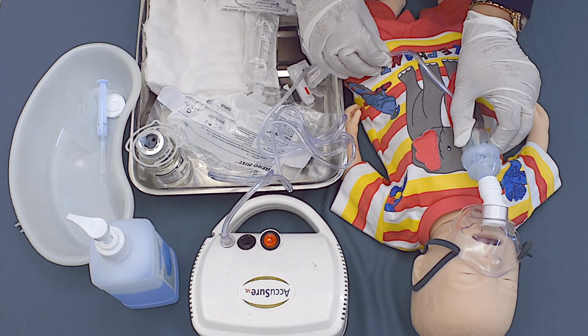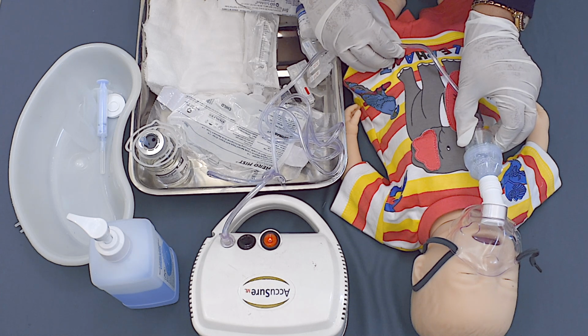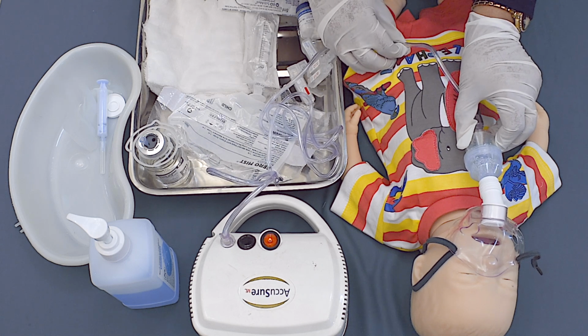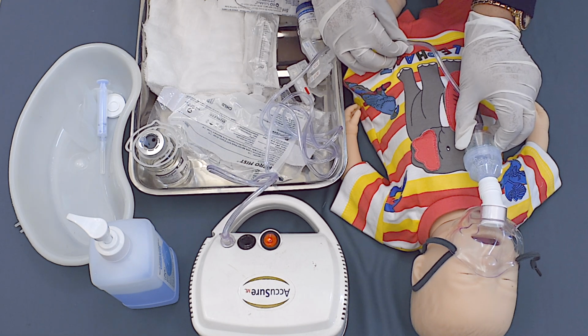While the baby is inhaling the fumes, instruct the baby or the child, if the child can understand, to breathe in deeply and breathe out through the mouth. After the face mask is attached, instruct the baby to breathe in through the nose and breathe out through the mouth. If the child is old enough to understand, explain about deep breathing to the child.